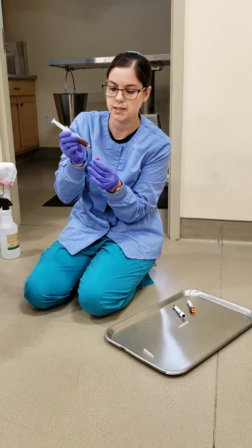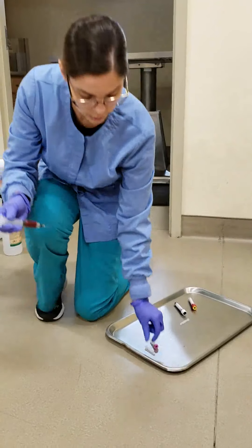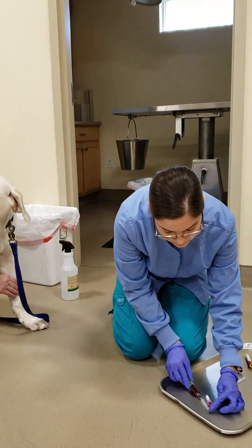This tube actually doesn't seem to be working, so let me just switch it out for another tube. That one is possibly — just needle it a little bit. But we also want to do it before our blood clots.